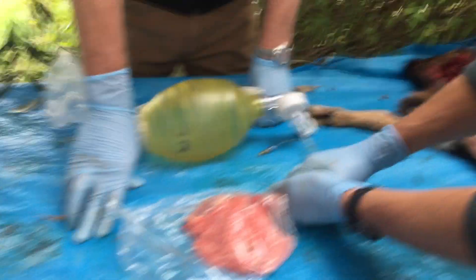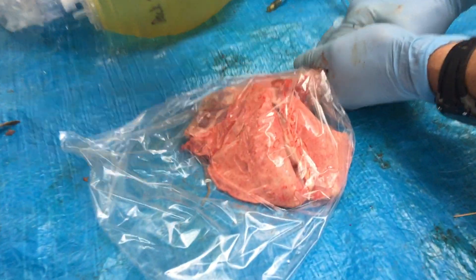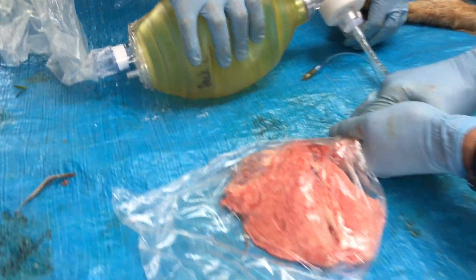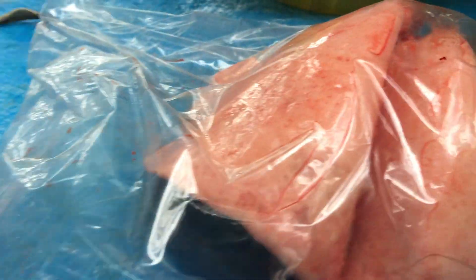A plastic bag mimics the pleura. Here we have some goat's lungs and a heart, intubated in a plastic bag to mimic the pleura. This lung does have a little hole in it, so we have a pneumothorax — just around the side, just a little punctured lung.